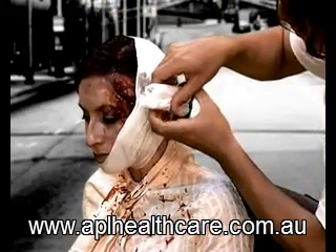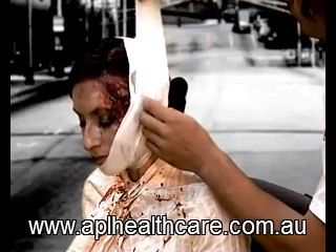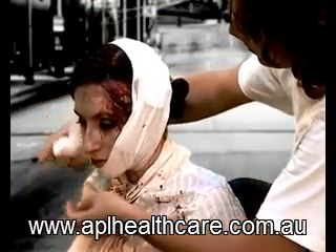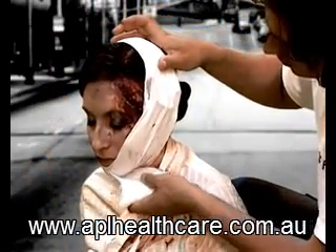The wrapping leader cups the chin, holding it firmly and comfortably in place while allowing unhindered breathing and speech. With each revolution, position the elastic bandage to achieve the level of pressure and comfort that is required.